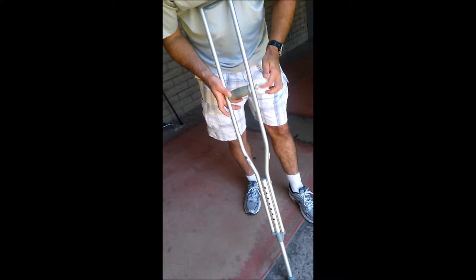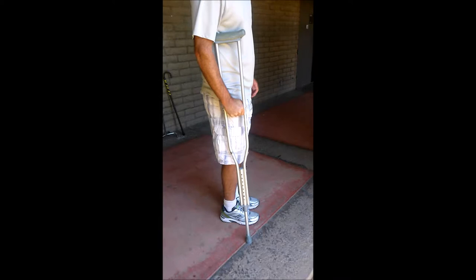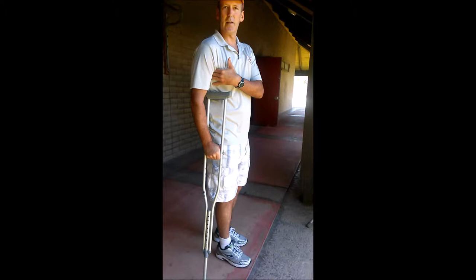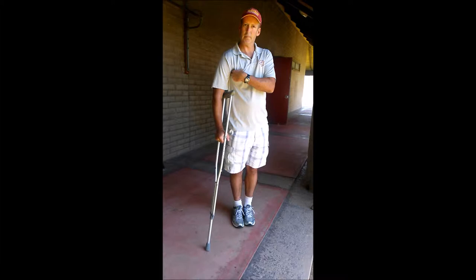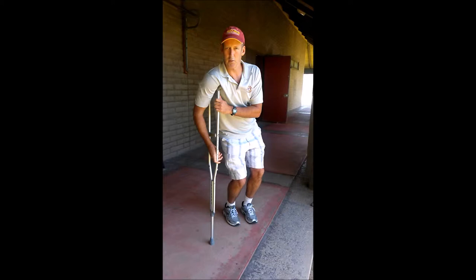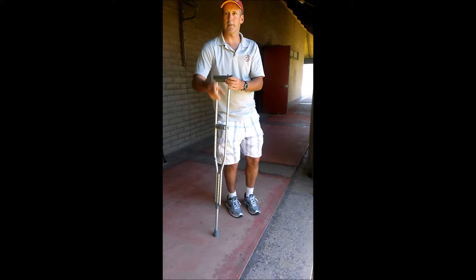Ideally with the handhold, I want about a 15-degree bend in my arm. My handhold here is fine, but this one is still way too short for where it needs to fit in my armpit. Usually what we'll do is go six inches out and forward, and I should be able to slip two fingers in my armpit. When teaching someone how to walk on crutches, they're not resting their arm on the crutch because that'll compress the axillary nerve - they're pushing up a little bit and keeping about a two-finger width there.